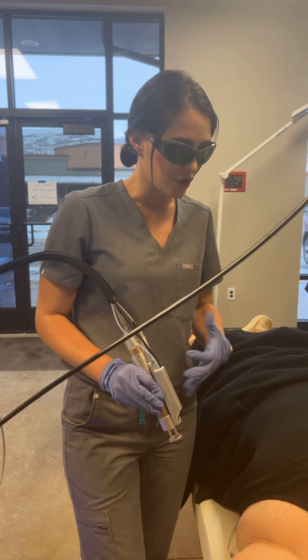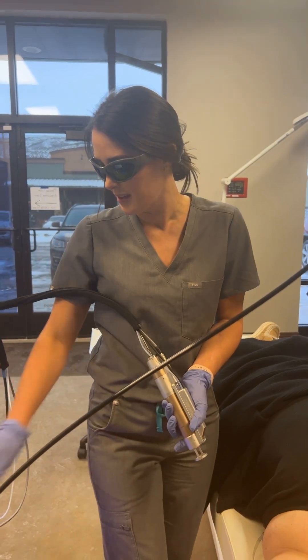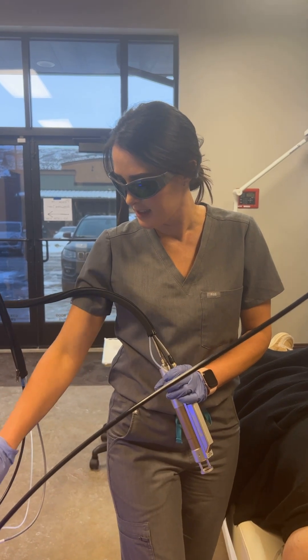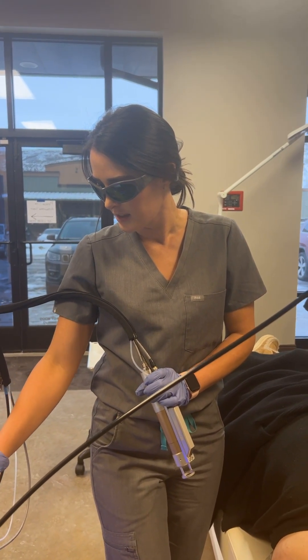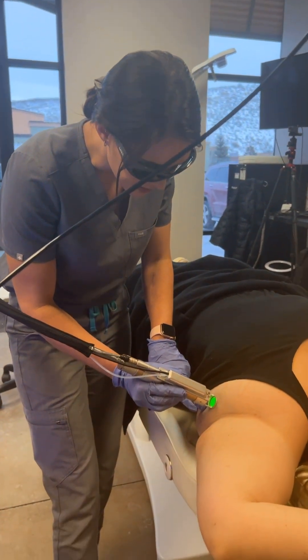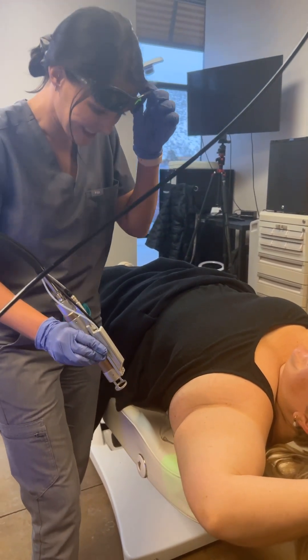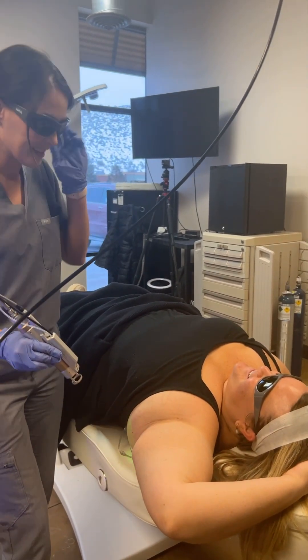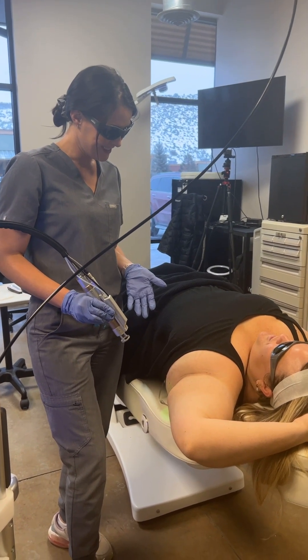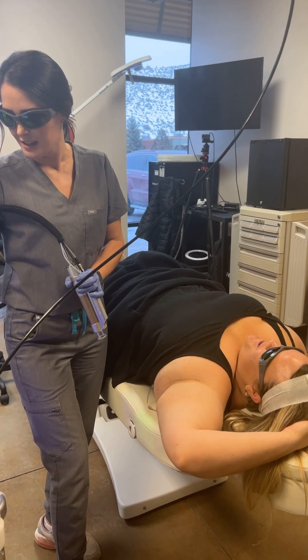You're going to feel like a rubber band snap, but you shouldn't feel any heat. This is going to be a lot more comfortable than waxing on its own. How'd that feel? Oh my gosh, amazing — like nothing. You smell that? That's actually the hair being affected by this. Oh really? Yeah — the smell of success. Way better than waxing.